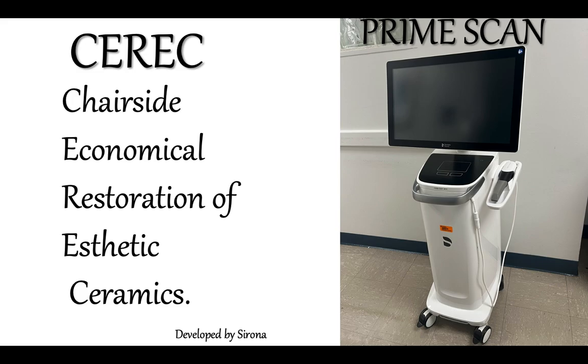It was created with the intention that the composite or ceramic indirect restoration is completed in the same 2-3 hours of the first appointment. We don't have to call back the patient for a second appointment. That was the idea, that we don't have to send to the lab.